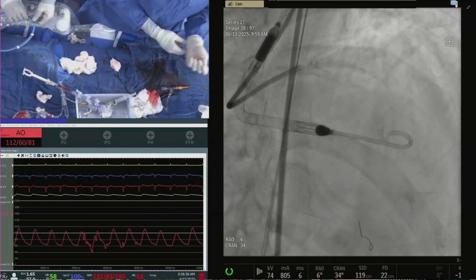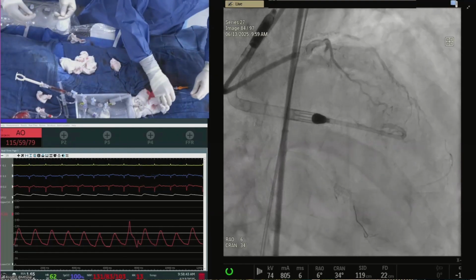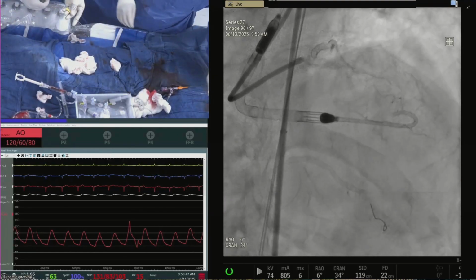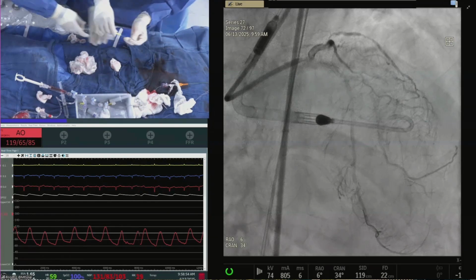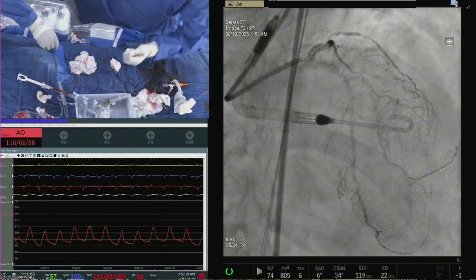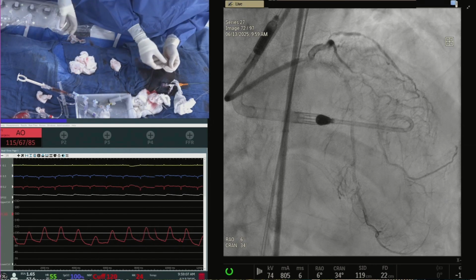Now you're going to dilate and then image, or when are we going to see some imaging here today? No, let's just wire it and then decide. I think imaging catheter is not going to go, that's number one. You don't want to mess around now. Balloon angioplasty, then image. In arteries like this, we just need to dilate first and see after we stabilize. I actually think you could put a long 2.5 balloon in, get this whole thing open, and then image to find out where you're going to put the distal stent and how large you're going to expand it.